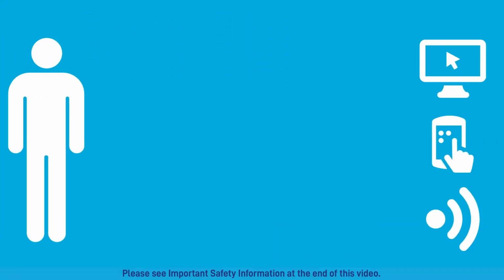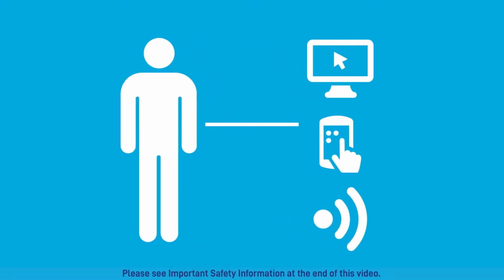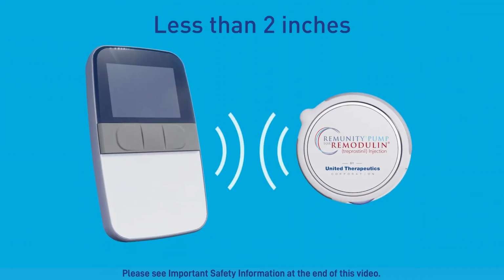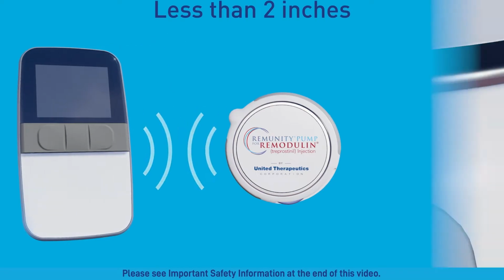If your pump won't pair with your remote, there may be wireless communication interference. Move at least 3 feet away from cell phones, Bluetooth devices, equipment that sends or receives radio waves, and Wi-Fi equipment, and try pairing your pump and remote again. Make sure your pump and remote are within 2 inches of each other and away from other electronics.